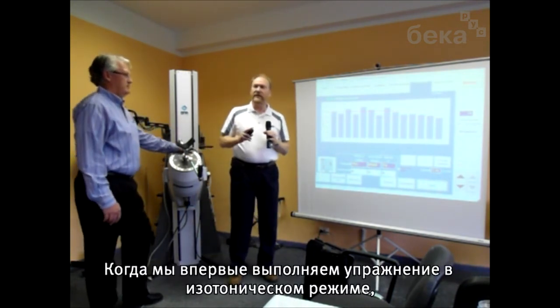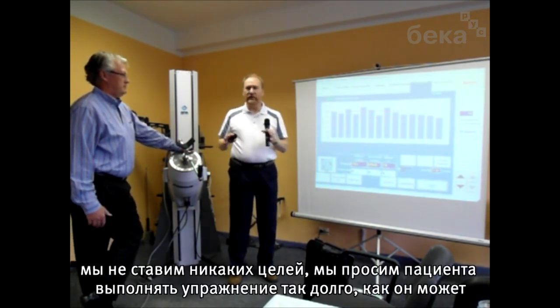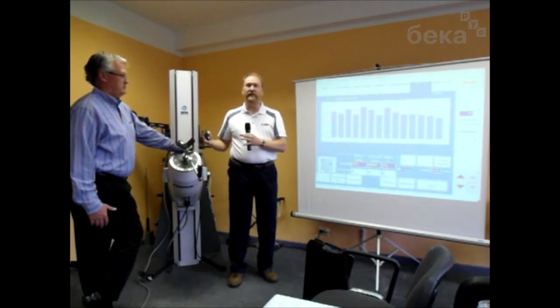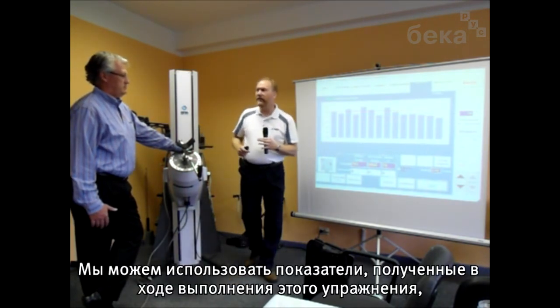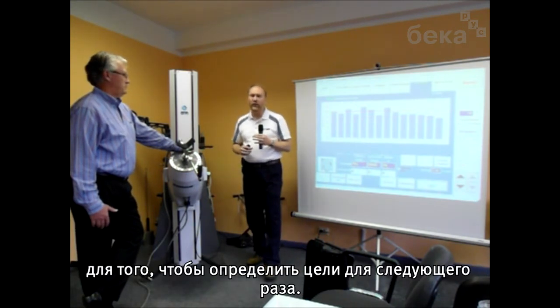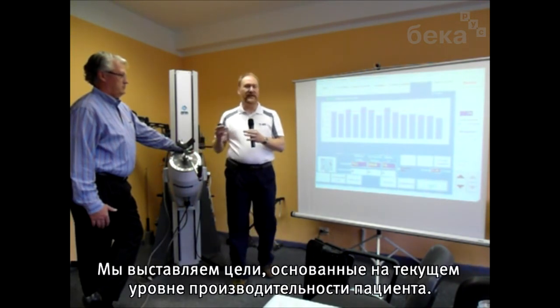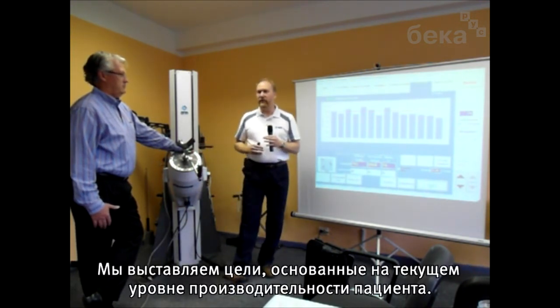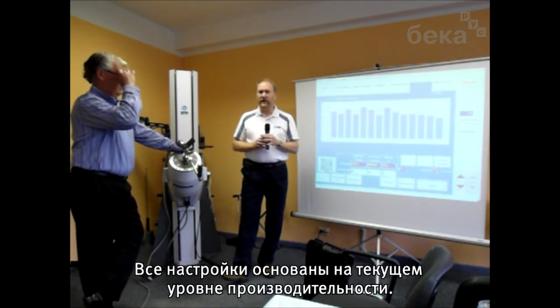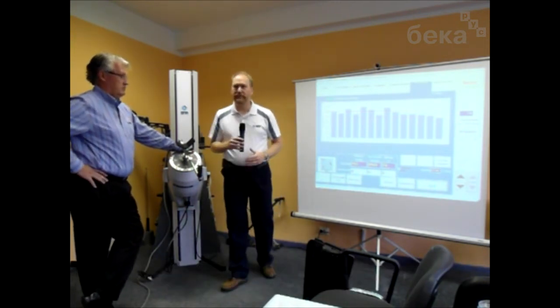So the first time you do an exercise in the isotonic mode, we're not setting any goals, we're just letting the person work as long as they can until they reach the point of fatigue. We can then take the information that we've collected from that exercise and determine what the appropriate goal is for that person for the next time that they come in. So we're setting the goal based on their current performance level. It takes all the guesswork out of it. It's always based on that person's performance.